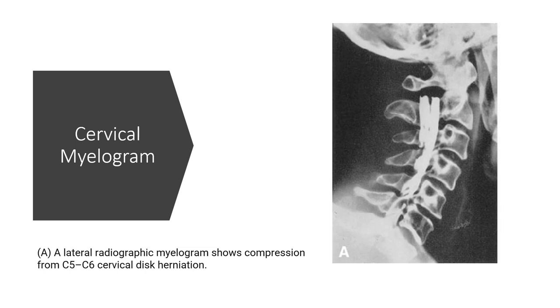Cervical myelogram. The picture is demonstrating a lateral radiographic myelogram that shows the compression of a C5 and C6 cervical disc herniation.